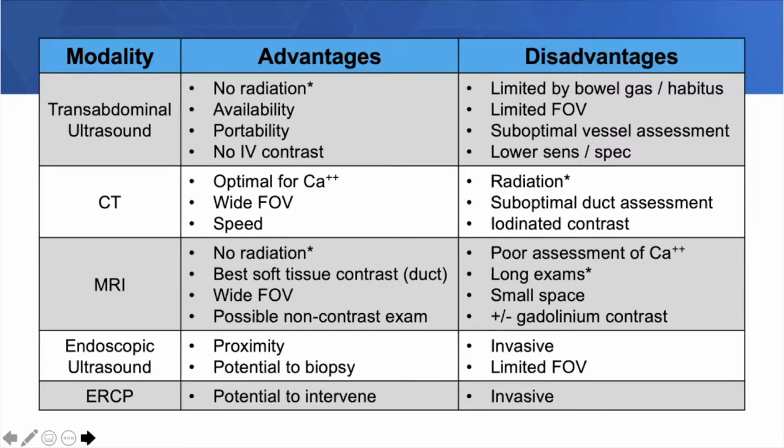So it's a very good starting modality for a lot of the diseases we talk about. But you've all seen this clinically, right? It can be limited in the bigger patients, and the world is getting bigger, or at least the people in the world are getting bigger. So ultrasound is more and more being limited, and can also be limited by bowel gas. And it really doesn't quite get the job done when it comes to assessing the blood vessels for complications in surgical planning. CT, we talked about radiation already.